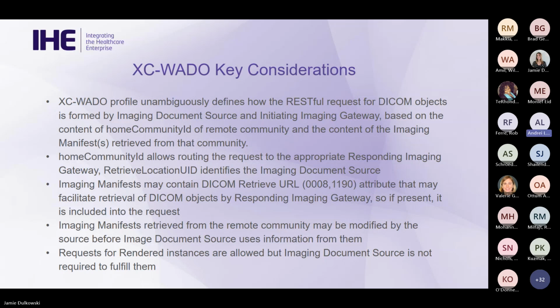The final note is I mentioned that the profile allows for retrieval of rendered instances.